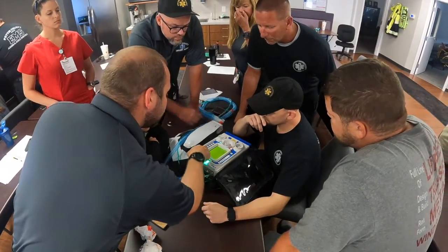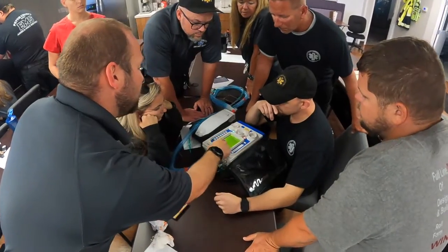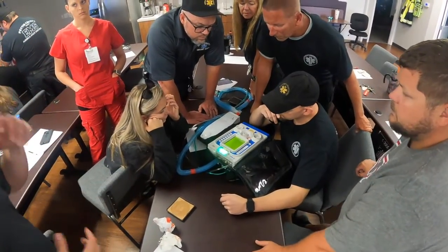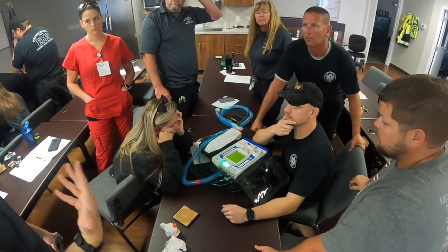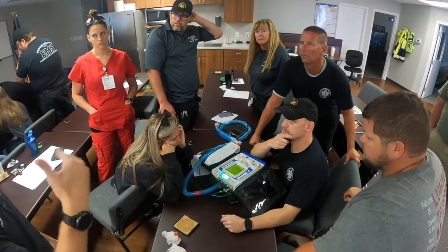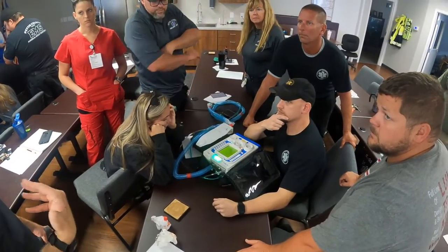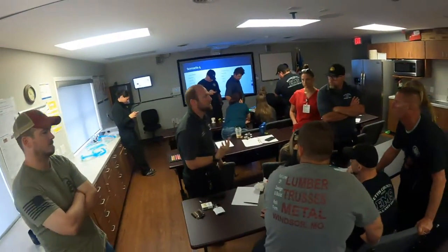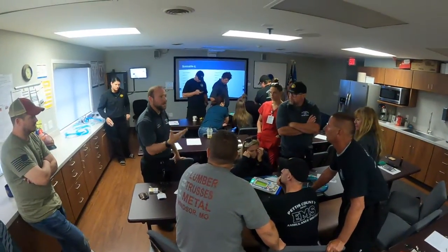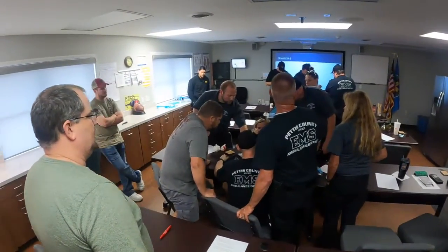There it is. So you're going to pressure, trigger level, -2. What this is a response to is the patient's ability to trigger a breath with the ventilator. When it's less than -2, we're seeing an increase, meaning it's a lot harder for the vent to actually trigger because they have to take a deeper breath, because we're thinking negative numbers, thinking negative pressure.